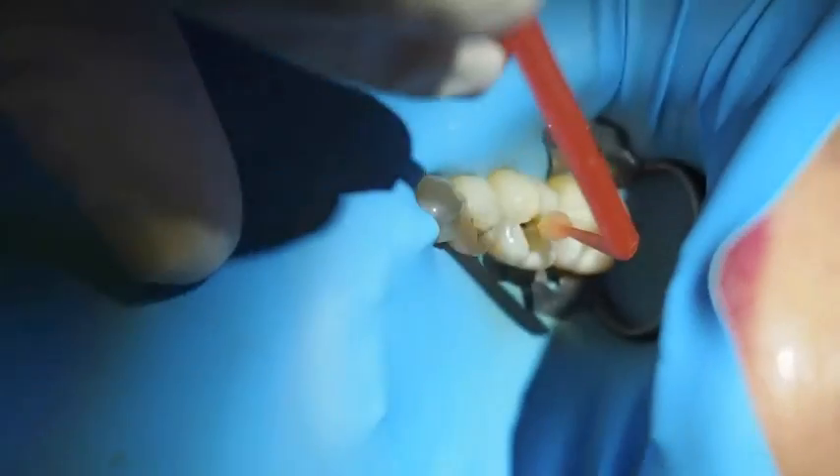Self-etching adhesive — this is ClearFil Essiity Bond. It stays on for 20 seconds and then it's air dried. Then goes the final layer of adhesive which is air-thinned. I prefer to add a thin layer of flowable to the adhesive before I cure it, just over the dentine areas basically to reinforce the adhesive. It's very thin and you have to cure for longer because you're curing both adhesive and flowable resin.